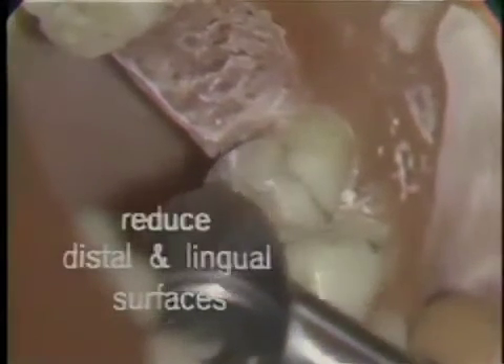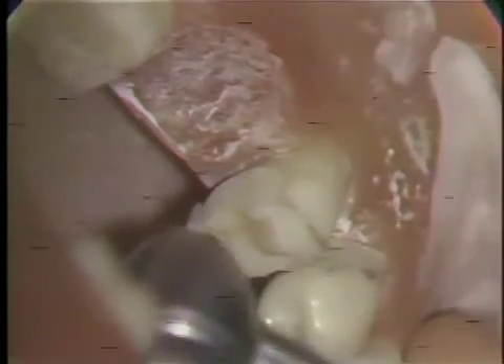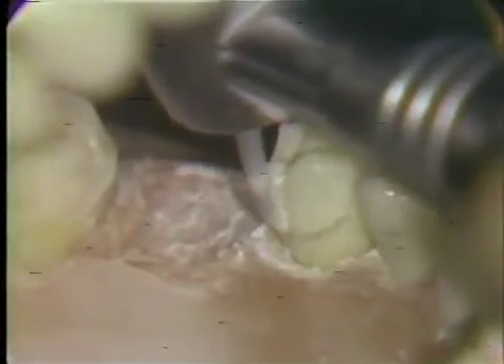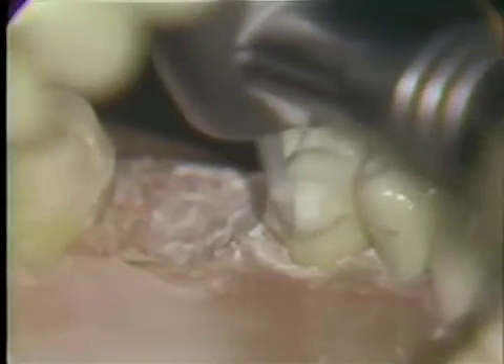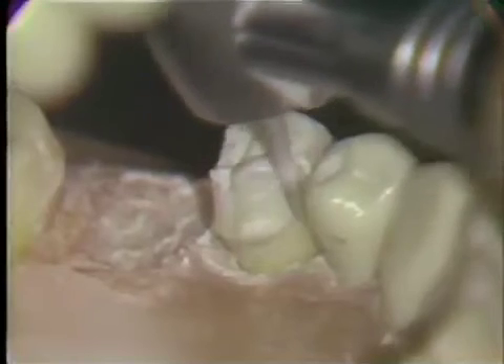Using the same diamond, the lingual and distal surfaces are reduced to the depth of the tracer cuts. When the distal slice has been completed, using the peripheral pencil marks of the preparation as a guide, the lingual surface is reduced, taking care to go no deeper than the tracer cuts and keeping the cuts as parallel with the long axis of the tooth as possible. You'll note that the tip of the diamond touches the pencil line outlining the cervical finishing line. As we approach the mesial of the tooth, care must be taken not to cut the adjacent tooth, as this diamond is slightly wider than the diamond used for slicing.